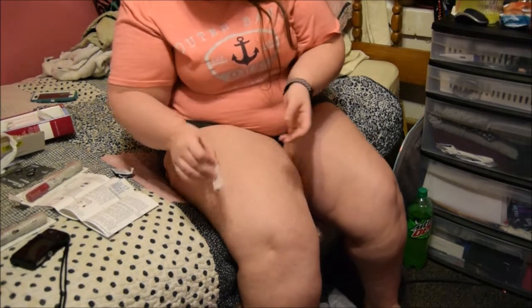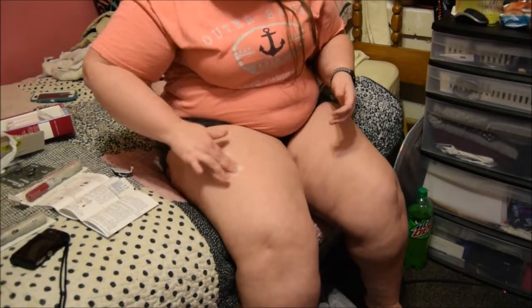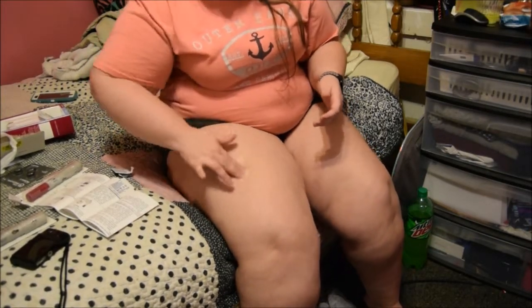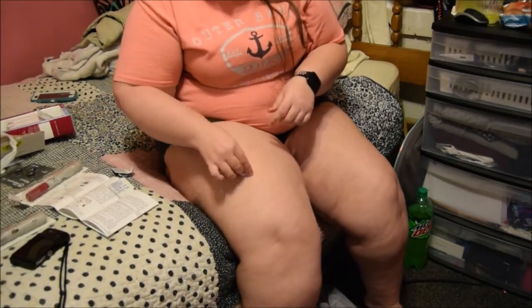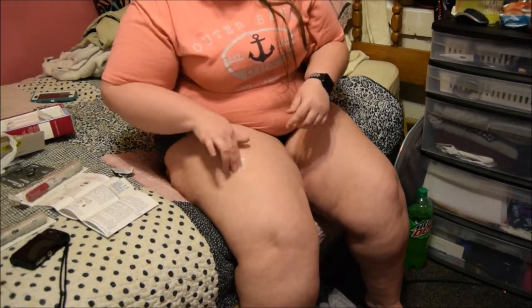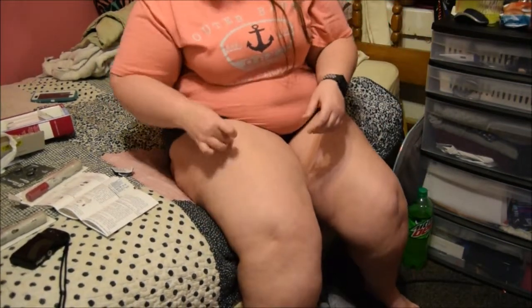So I'm going to open this up. I'm going to swab this section that I'm going to inject in, which is right in the middle of my leg, because the last time I did one here and here. So I'm going to do in between the 2. You don't want to inject them in the same spot that you injected the previous ones. So there's that.